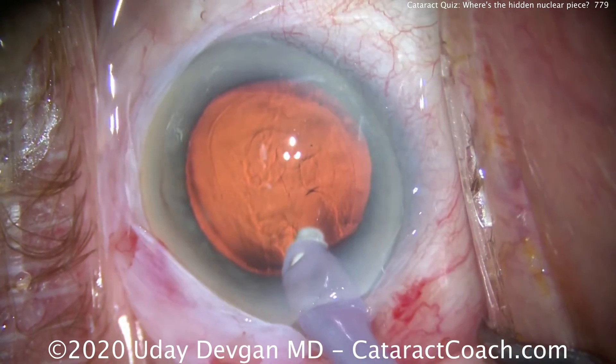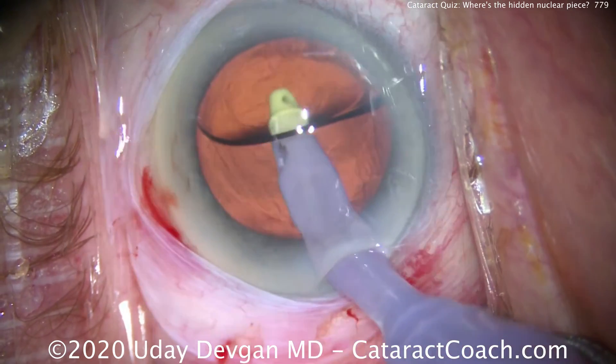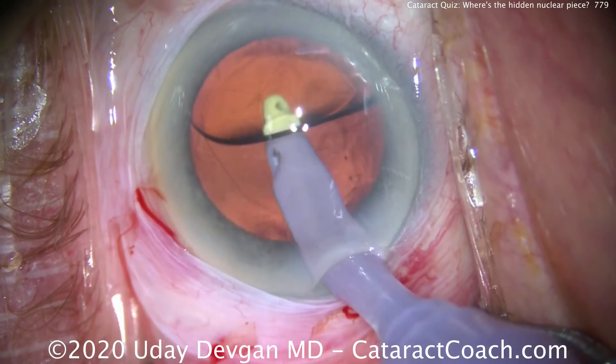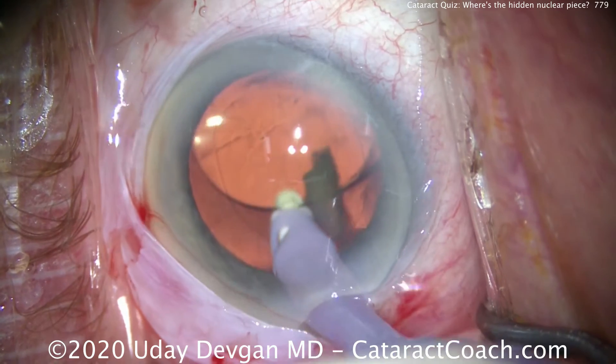We'll go under here, remove viscoelastic, and that piece will be dislodged from the angle of the eye. Watch carefully — it'll go under the optic. Coming up — one, two, three — there it is. You've got a huge piece of nucleus.